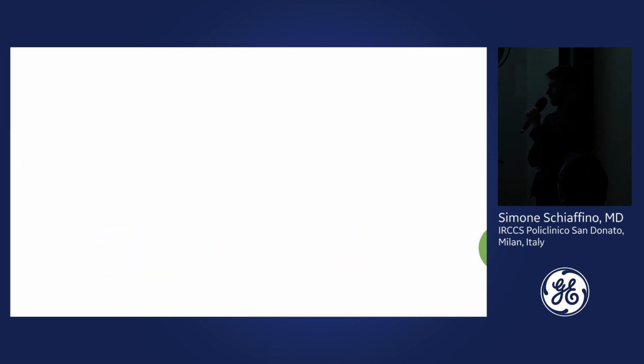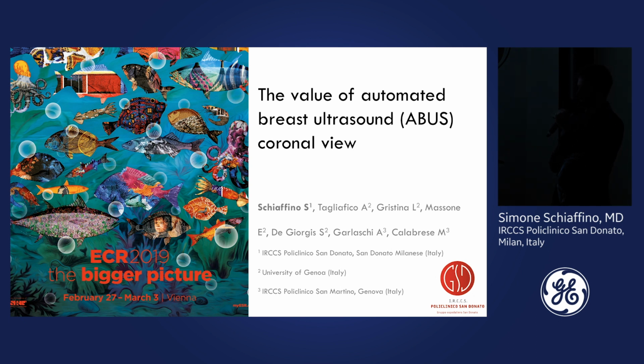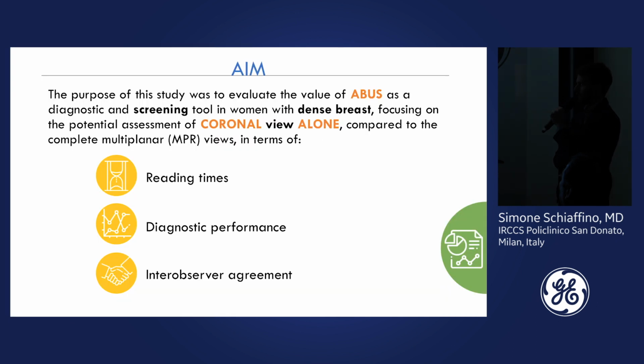This is the study that I presented yesterday at the breast ultrasound session here in Vienna, and we're going to publish this study in the Journal of the Asian Federation of Ultrasound in Medicine. The purpose of our study was to evaluate the value of ABUS as a diagnostic tool in women with dense breasts, focusing on the potential assessment of the coronal view alone, compared to the multiplanar views in terms of reading times, diagnostic performance, and inter-observer agreement.